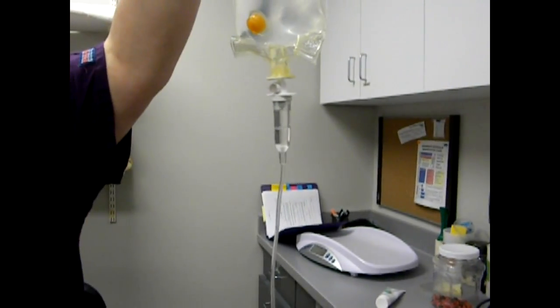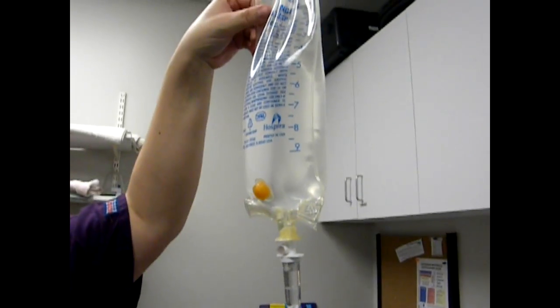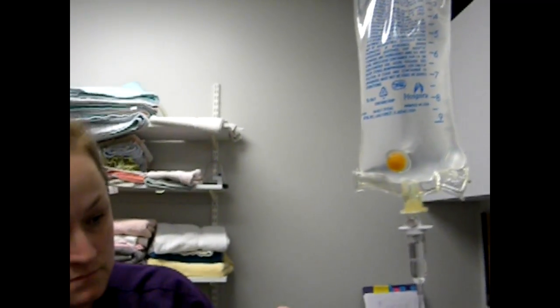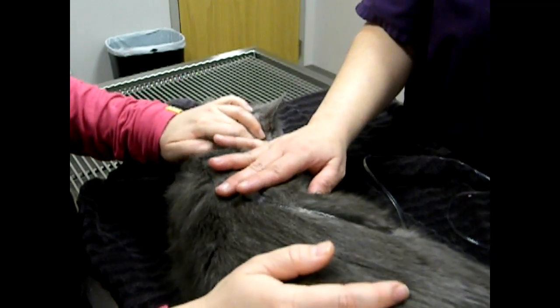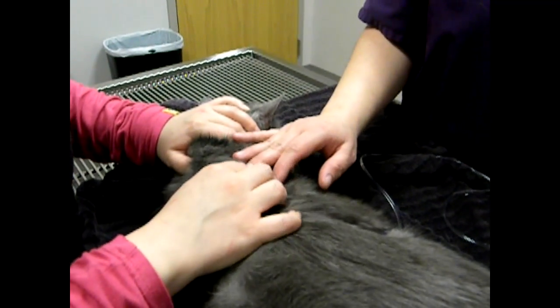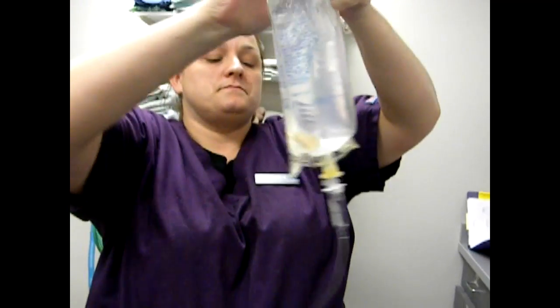And we're going to go to the two, because we've already used 50 of this bag. Can you hold your hand right there? Thank you. Give it a little squeeze, so Cash doesn't have to sit here as long.